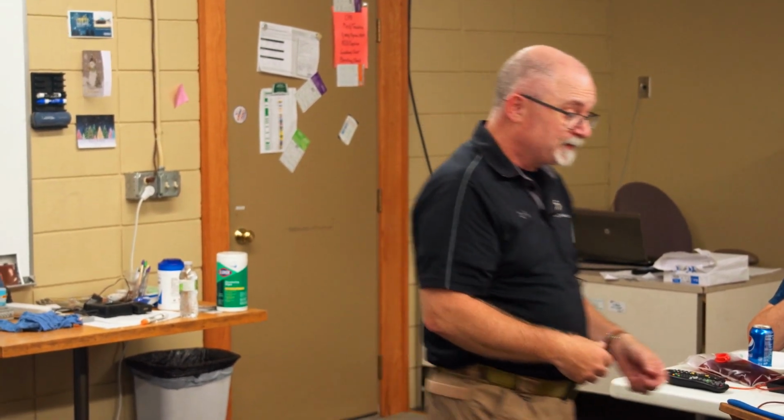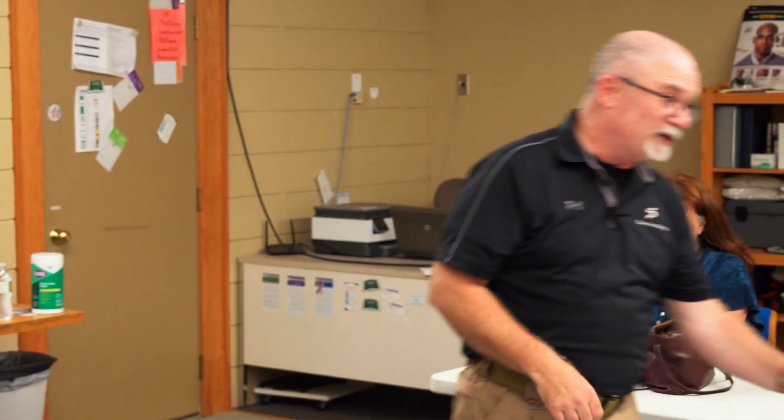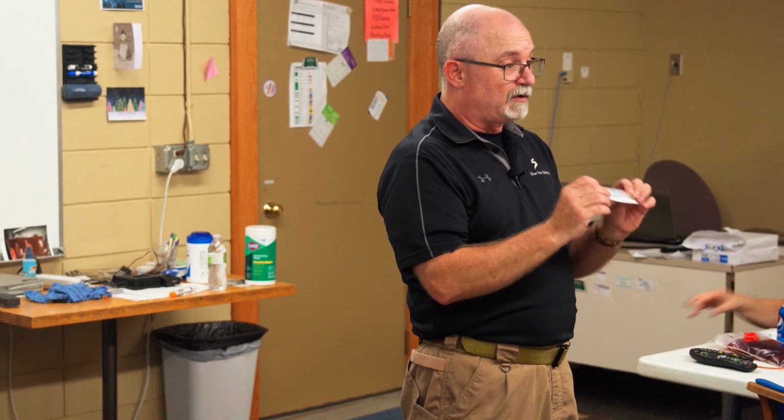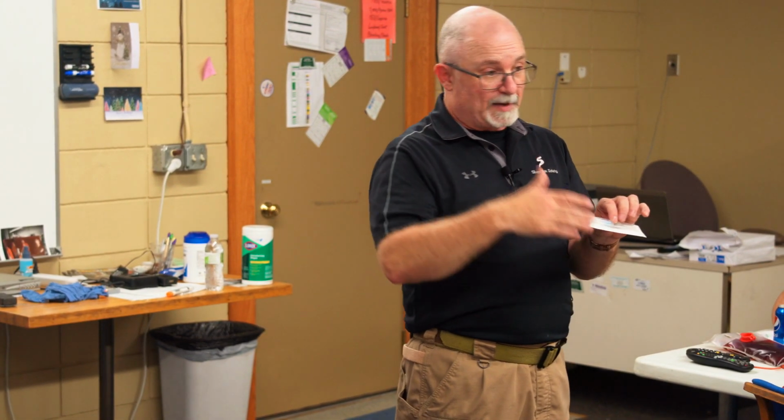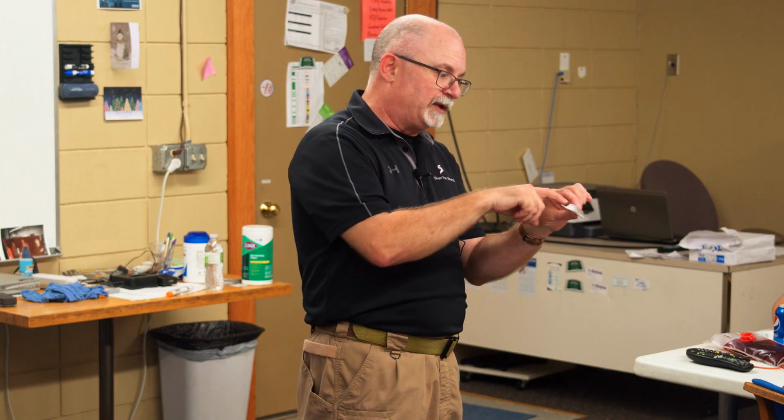It's more just the size of the vein. Some of it has to do with how much volume you want to be able to put in. Because if we have somebody that's very dehydrated and we really want to fluid resuscitate them, this 22 is going to take an awfully long time to get through. So I'll even go back to the D50 when we would use that. That's like corn syrup. It would take me half an hour to push that thick fluid through this teeny tiny little thing.